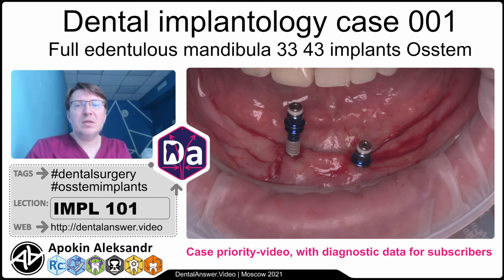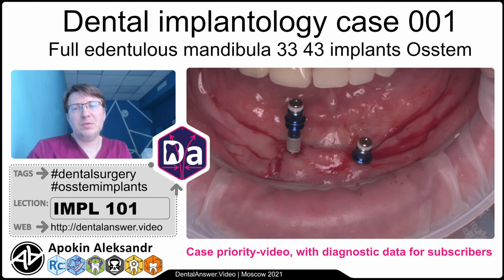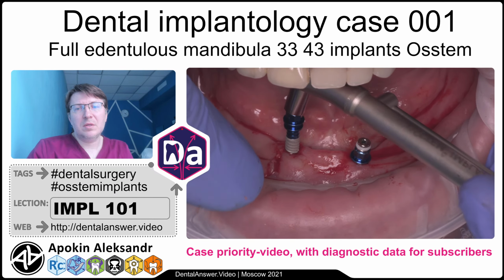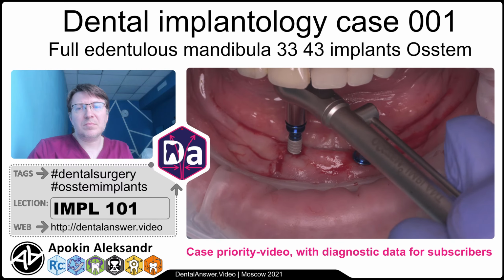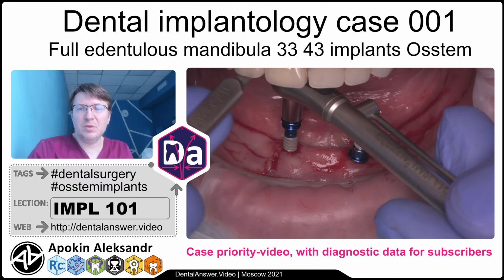On this side I have reached 13 Newton centimeters, and then I decide to insert the implant with hand insertion, not machine made.